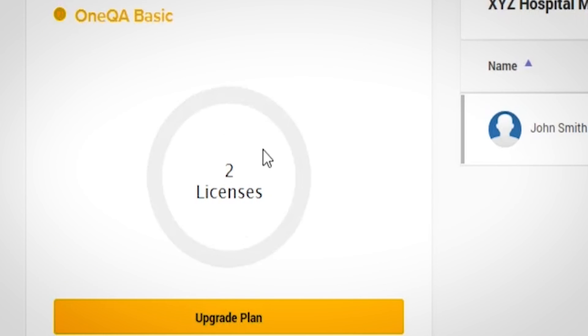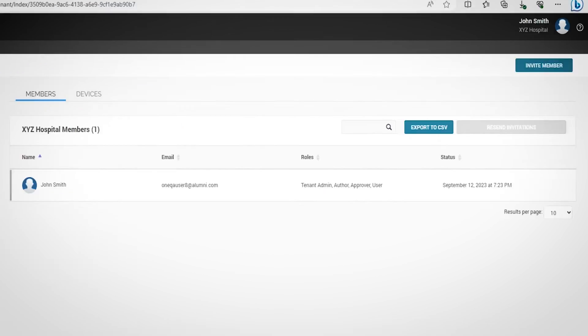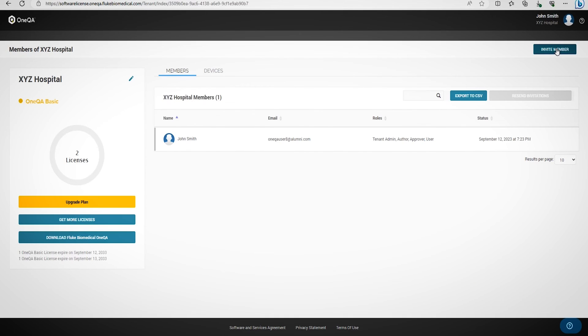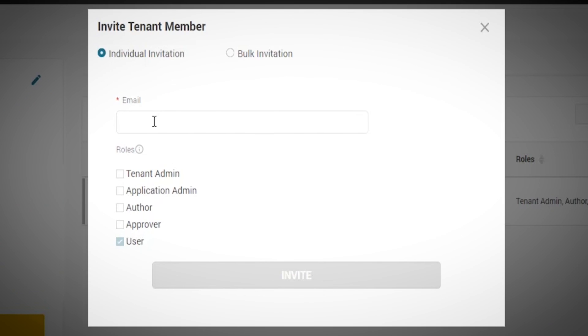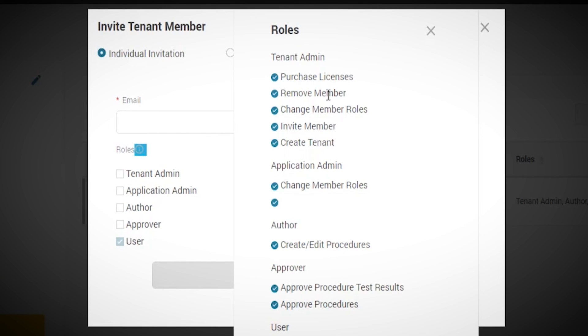Lastly, if you need to invite members to your team after the initial onboarding process, select Invite Member. Enter their email address and specify their roles as technicians. Clicking the information icon will provide details about each technician's role.